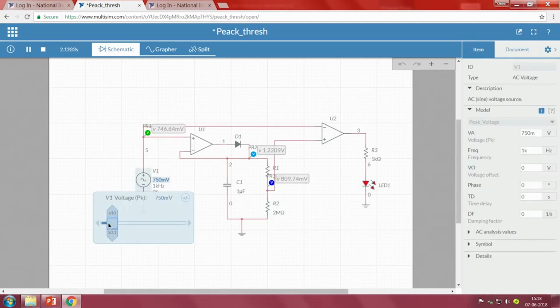So, make the amplitude 1 volt, okay. Then this frequency, let me decrease. We have to analyze. 100 hertz is also really too high to understand. So, let me make it 50, even that is too much, 30.